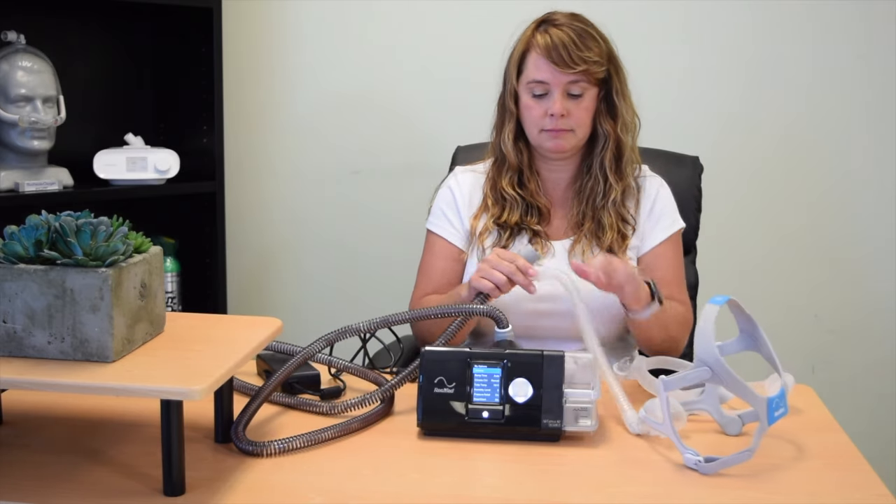Now I'm going to try to connect my new mask. It worked, no problem.